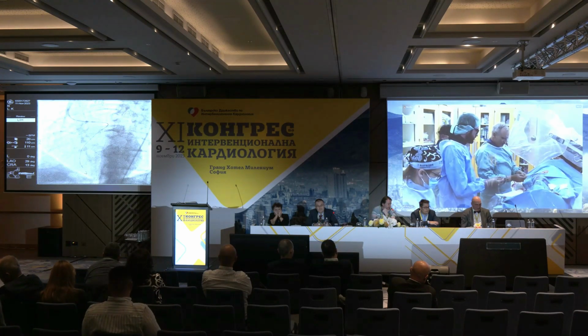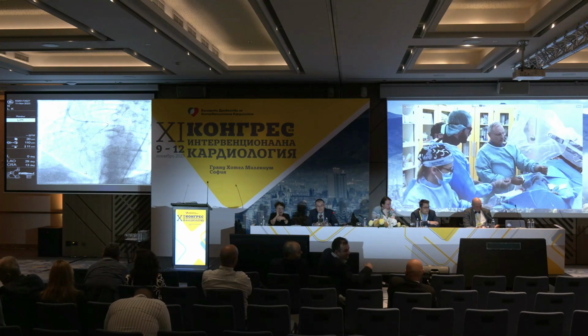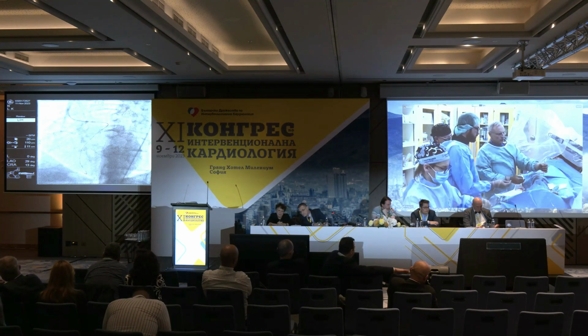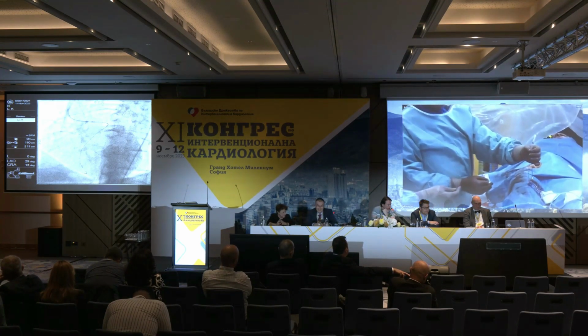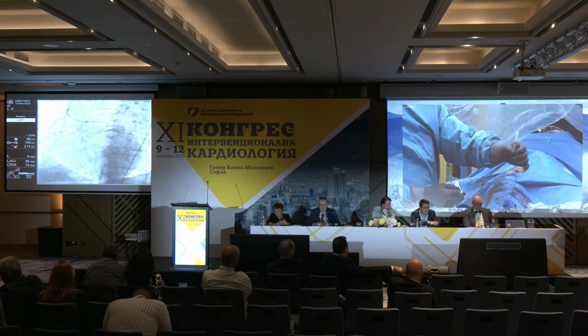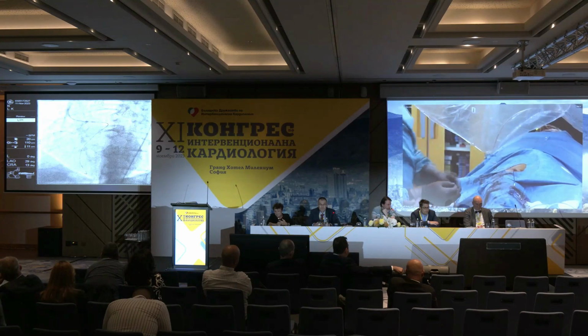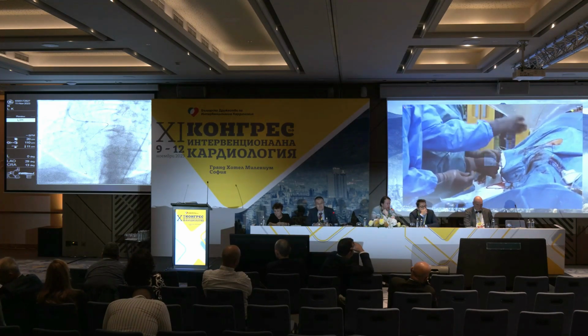So never rush mentally. One other thing that you have to do here is that we put a torquer just in front of the retrograde microcatheter, because we're going to work on this RG3. If by any means you have difficulties during the procedure and you don't have the wire anchored, it might dive into the guiding, into the microcatheter, and you might have problems over there.